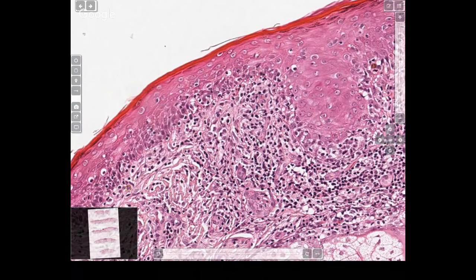And we see these cases in meetings. So you have to be sure that you don't end up with a case that is shown in a meeting, where this pathologist signed the case out as a lichenoid actinic keratosis or benign lichenoid keratosis and missed a regressing lentigo maligna. These cases tend to end up in meetings. So always think about it.